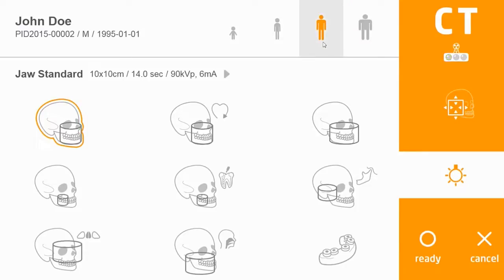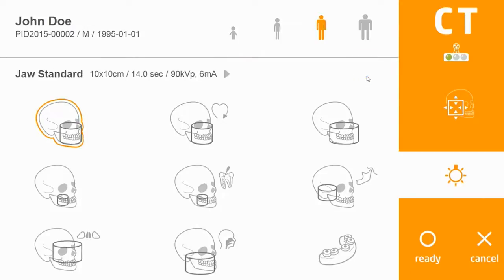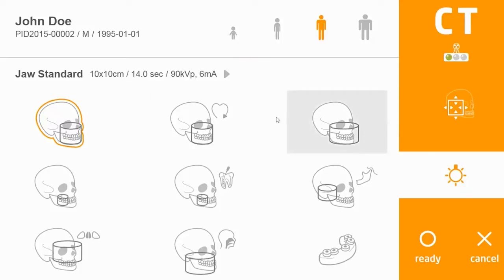You will notice it defaults to the medium adult. You also have the option to change the kV and mA settings. In the center you have protocol options — it is important to note that all protocols will activate the visible X-ray guide button to extend the diameter up to 12 by 10 height.